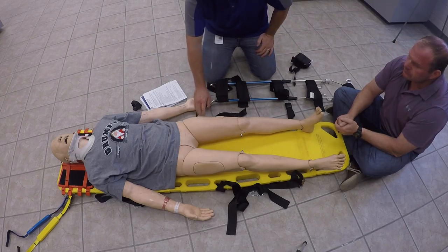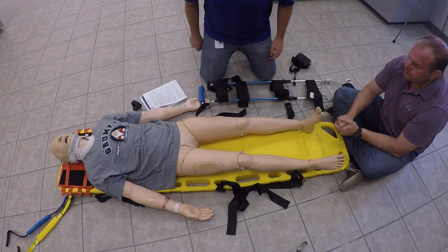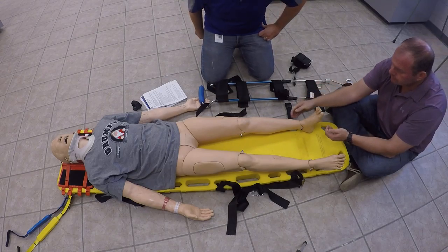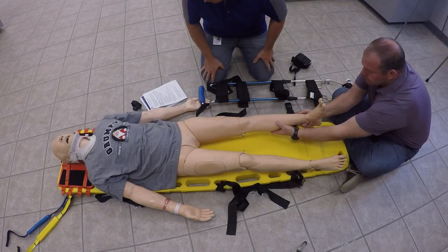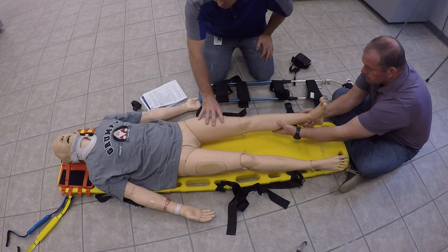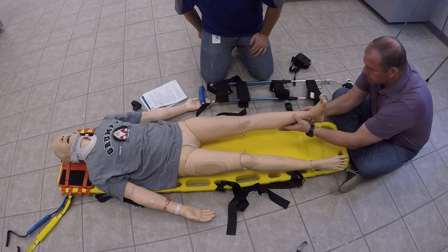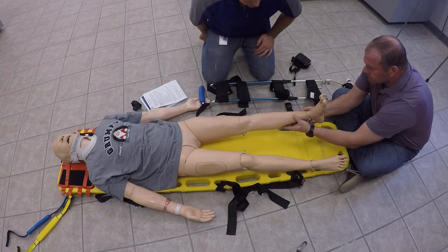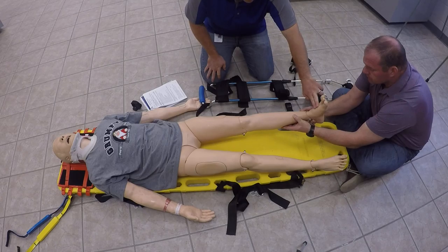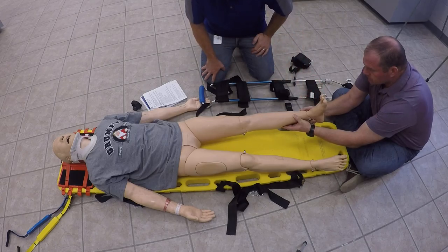We've already got the patient on the backboard here. We'll make sure we have PPE on if necessary. First thing we're going to do is have manual stabilization pulled and traction pulled on the leg, so we can go ahead and release pressure from that fractured femur. Once we do have traction pulled, we'll go ahead and assess PMS and make sure that we do have pulses intact and have them wiggle their toes to assess that.